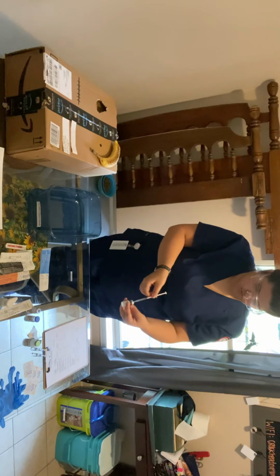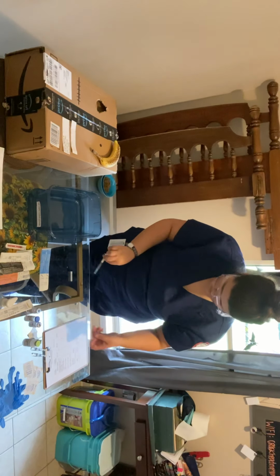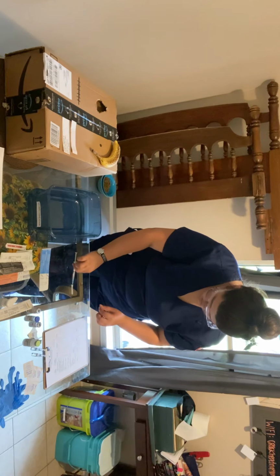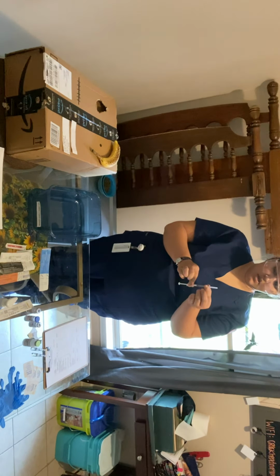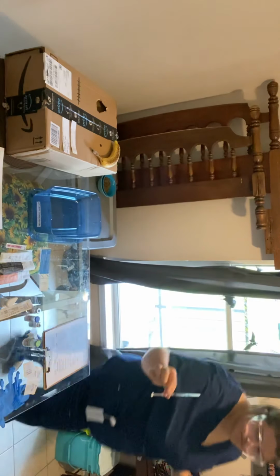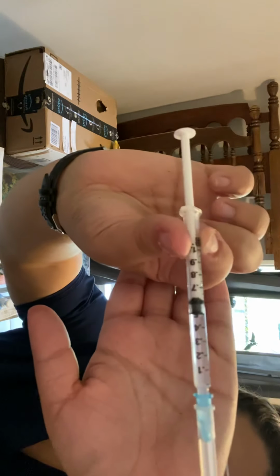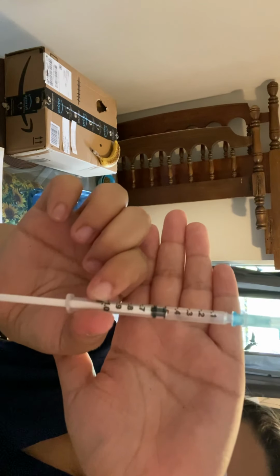I'm going to remove it from the vial. I'm going to scoop the cap and secure it. To maintain sterility, I will not touch the top of the cap. Now I'm just going to verify for the camera that I have 0.5 milliliters of heparin.